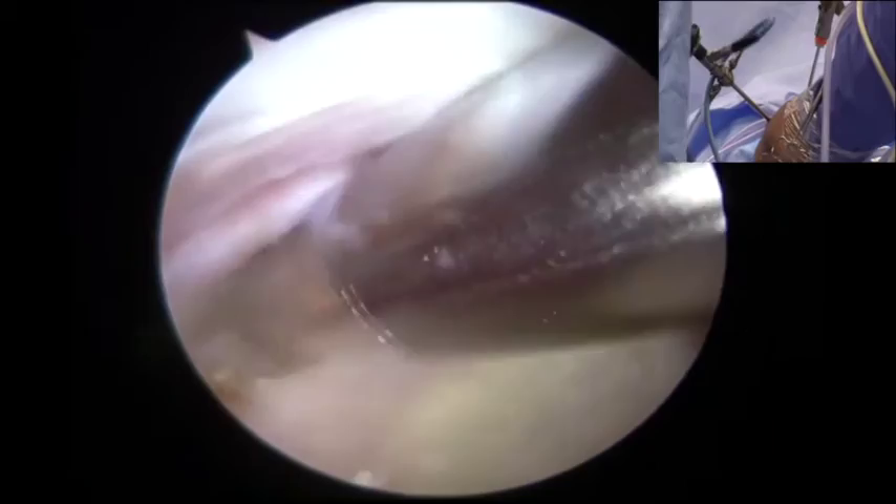The retracted rotator cuff tear was visualized. Utilizing a 4.5 shaver, the superior glenoid rim was debrided and then measured at approximately 15 to 20 millimeters.